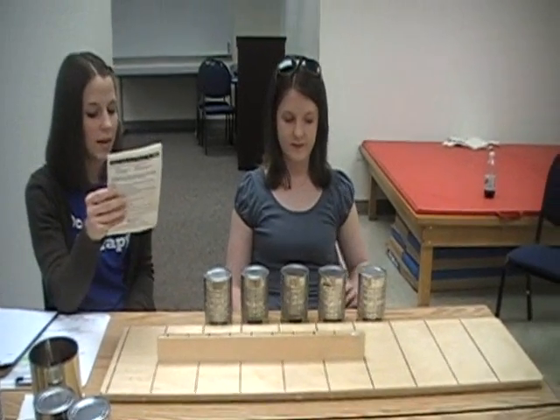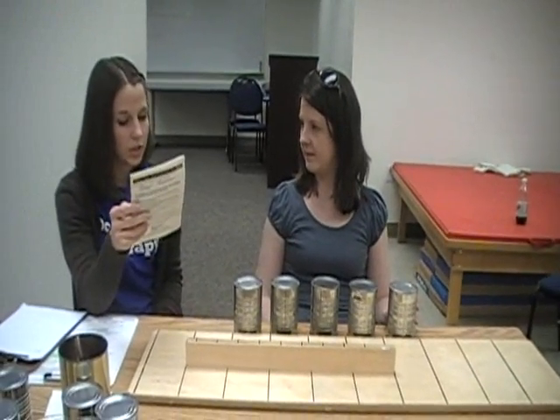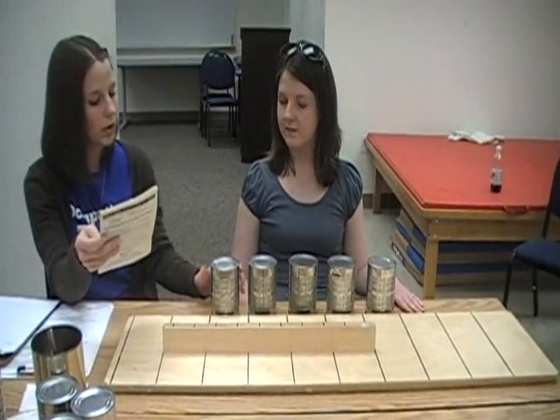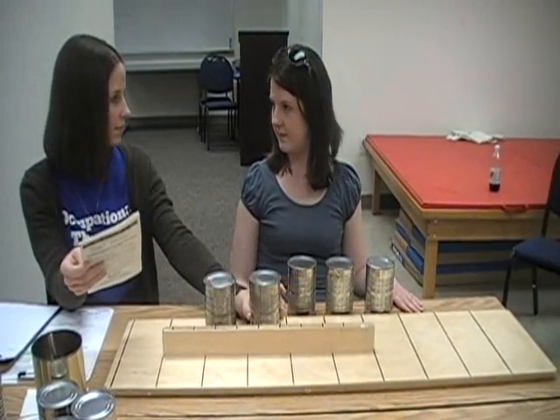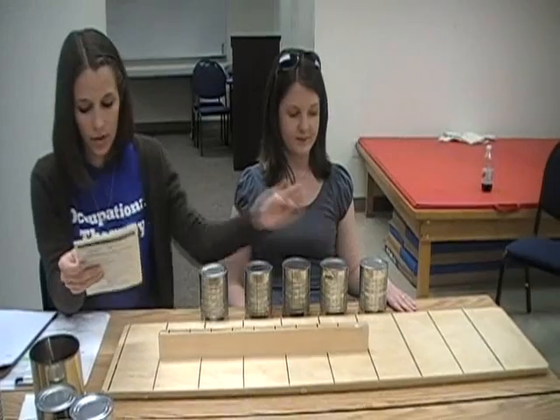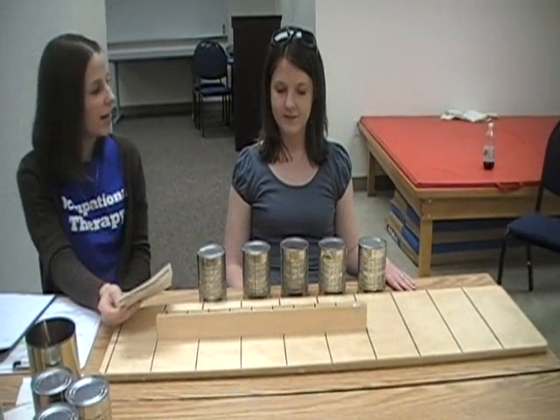Now do the same thing with these heavier cans. Place your left hand on the table. When I say go, use your left hand to stand these cans on the board as fast as you can. You will begin here. Do you understand? Ready? Go.